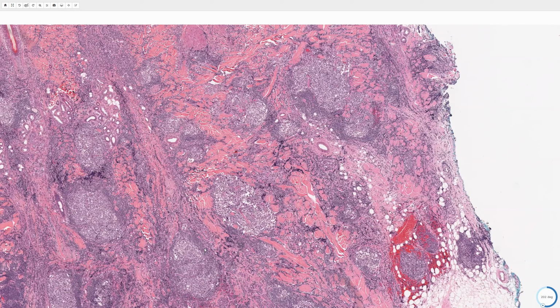And these lymphomas, most of them are going to be BCL6 positive. And if it's a secondary skin involvement and an underlying systemic lymphoma, those are oftentimes going to be BCL2 positive. So again, if it's a patient with an underlying systemic lymphoma, in those cases, these follicles here will show BCL2 expression. So important to note that distinction.